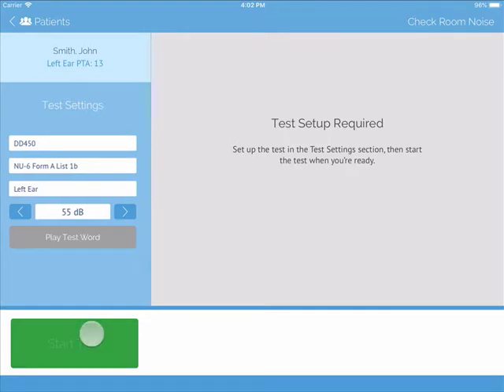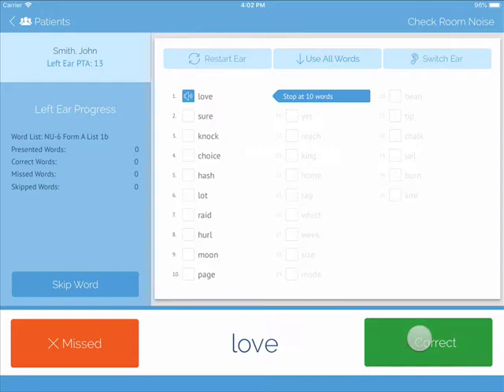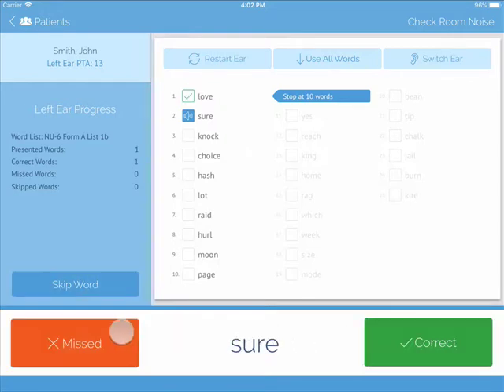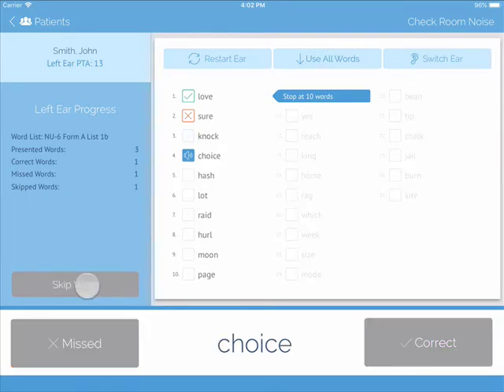Press Start Test. The word will present to the patient and they should recite it back. Confirm whether the word was correct or whether it was missed. You can also skip words if necessary.